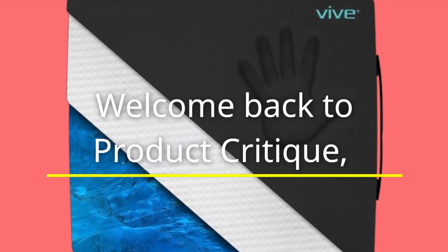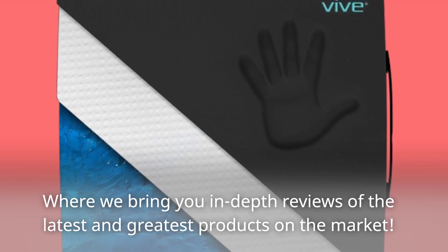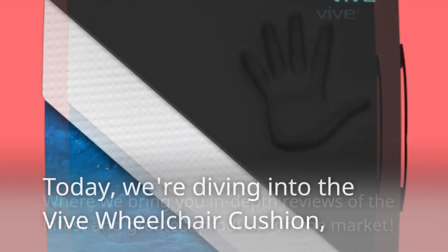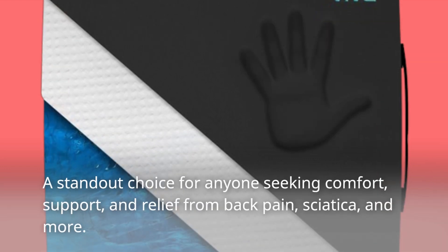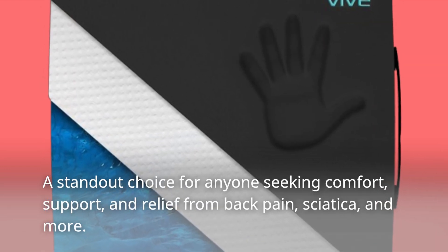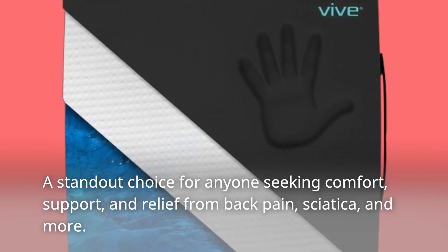Welcome back to Product Critique, where we bring you in-depth reviews of the latest and greatest products on the market. Today, we're diving into the Vive Wheelchair Cushion, a standout choice for anyone seeking comfort, support, and relief from back pain, sciatica, and more.